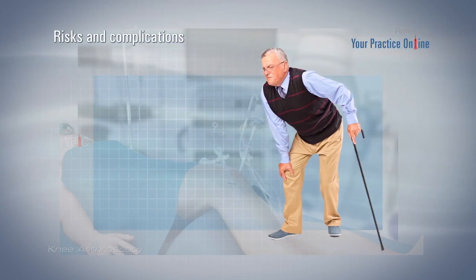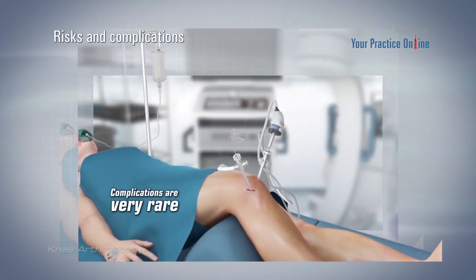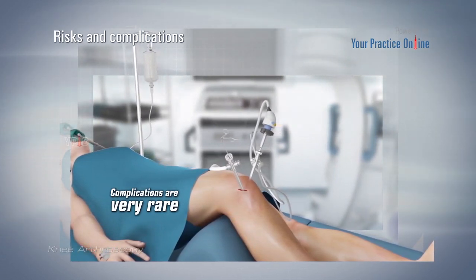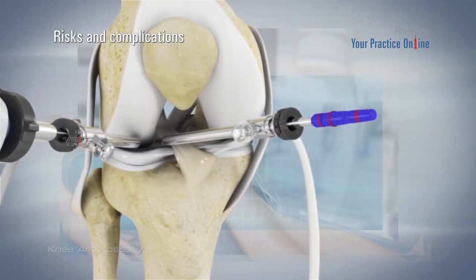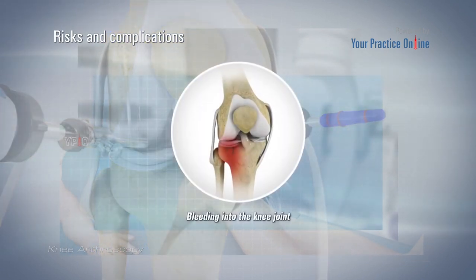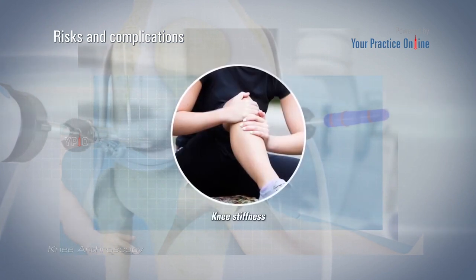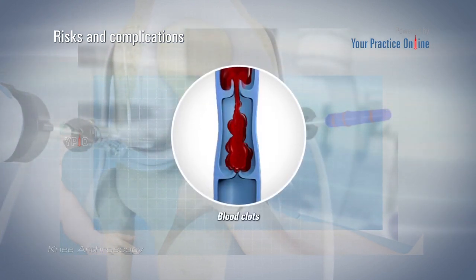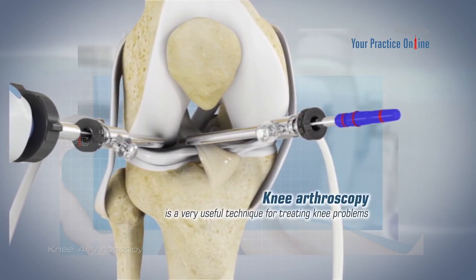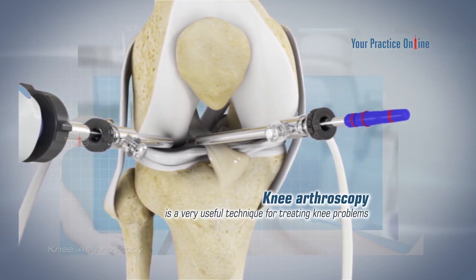Risks and complications. Knee arthroscopy is a safe procedure, and complications are very rare. Complications specific to knee arthroscopy include bleeding into the knee joint, infection, knee stiffness, blood clots, or continuing knee problems. Knee arthroscopy is a very useful technique for treating knee problems.